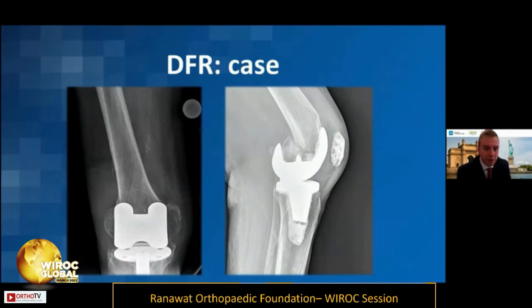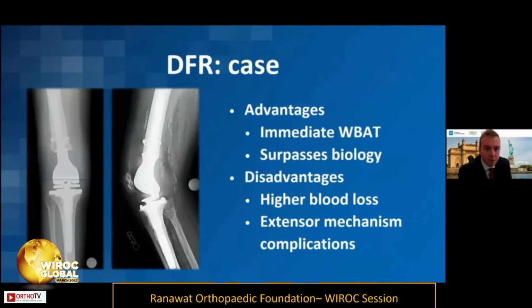Obviously, here's a supracondylar fracture. Both of the condyles are involved. There's even a non-displaced fracture up into the distal metadiaphyseal region in a very elderly, 80-year-old female patient. So for me, this is best served with a distal femoral replacement. You can see the cable placed for prevention of propagation of the fracture, and cemented stems on both sides.